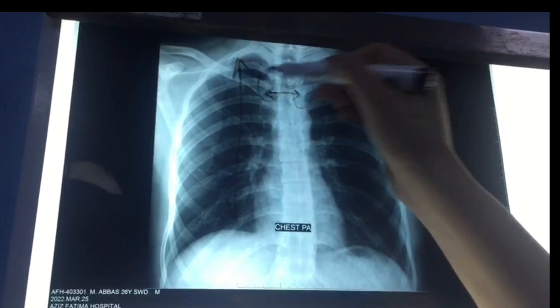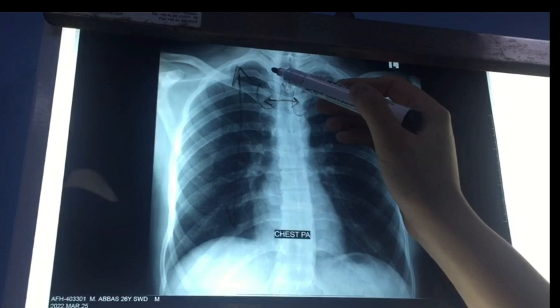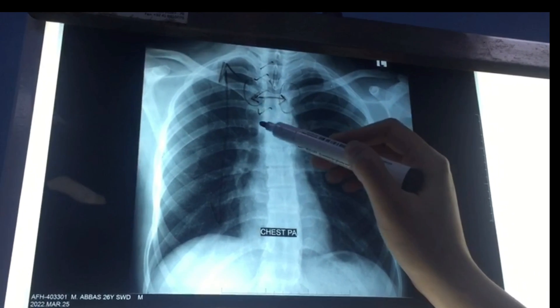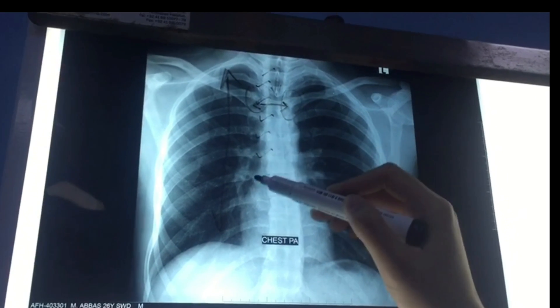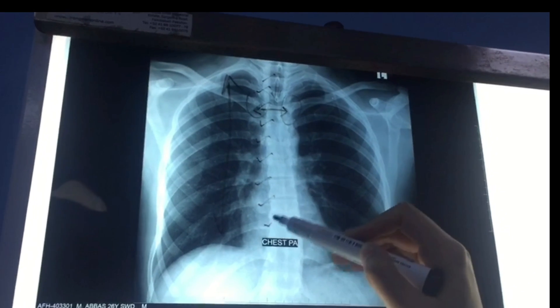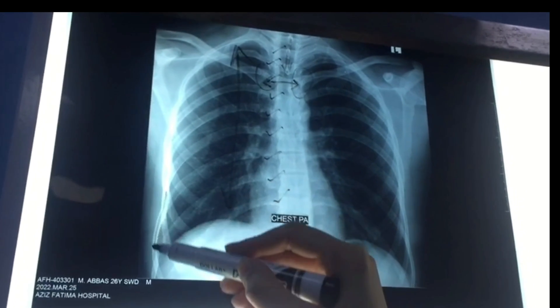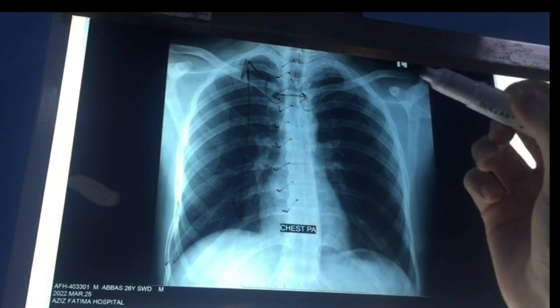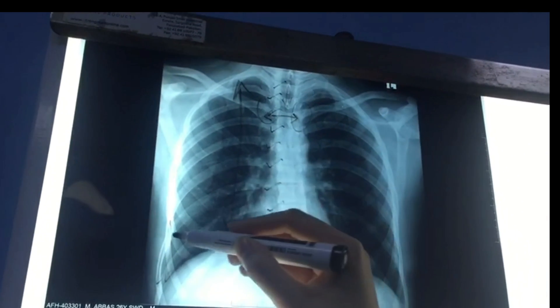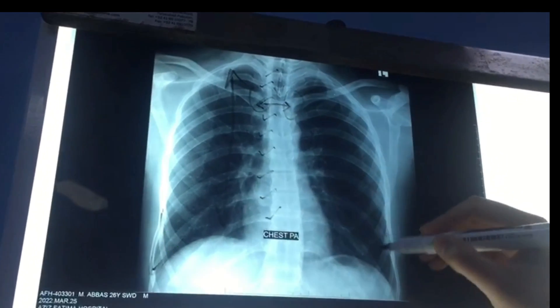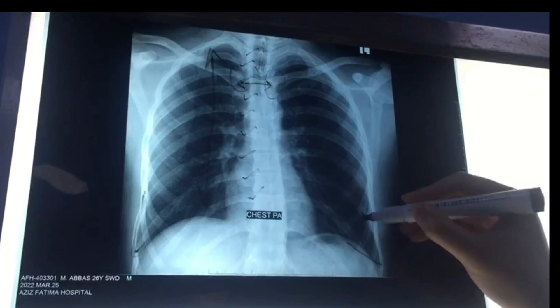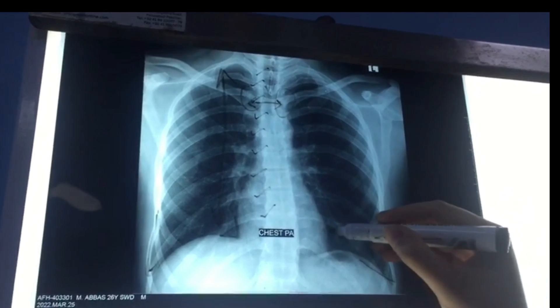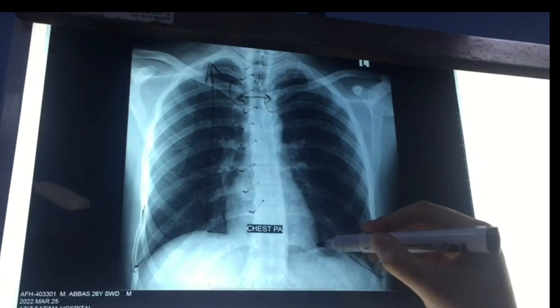After that, we will count the ribs — five, six, seven, eight, nine. Eight to ten ribs visible on inspiration is normal. This is the costophrenic angle, made by the hemidiaphragm with the lateral chest wall — on both sides it is normal, not obliterated. The cardiophrenic angle is also normal.